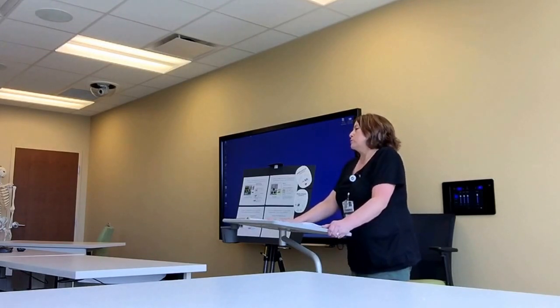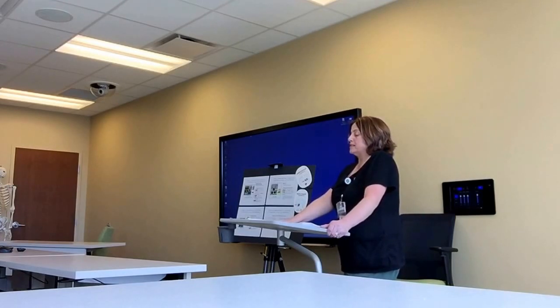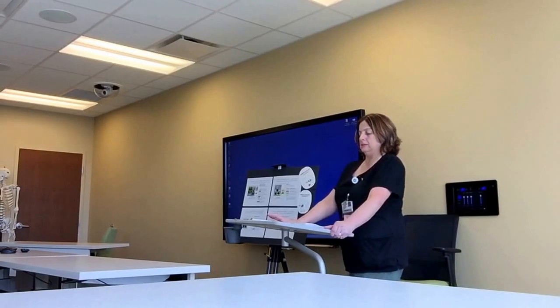Maybe get an epi every 2 minutes, or 3 to 5 minutes, and doing a rhythm check every 2 minutes. After the second shock, you might consider some amiodarone. And so I think I've covered everything. Just make sure on the pad you have the correct pad placement.